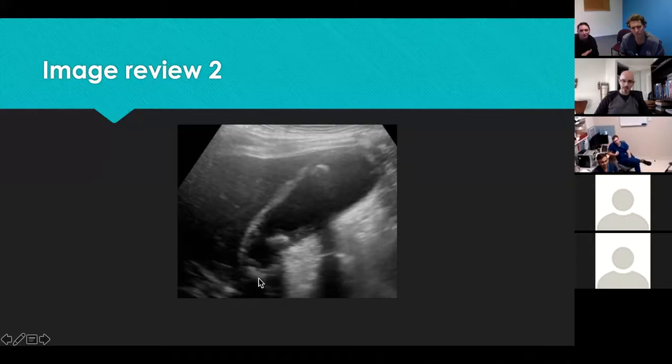If we want to see stones in the gallbladder neck, the best thing to do is to increase the depth a little bit, put the neck in the middle of the image and put the focus at that level, and that helps seeing the shadow a bit better. We don't appreciate this shadow partly because we don't have enough depth to see an obvious shadow like this. Does it make sense?